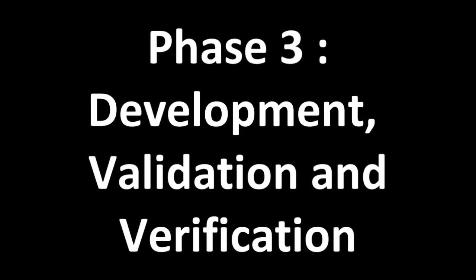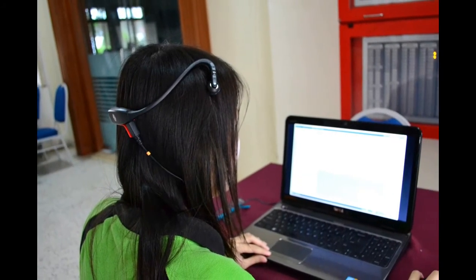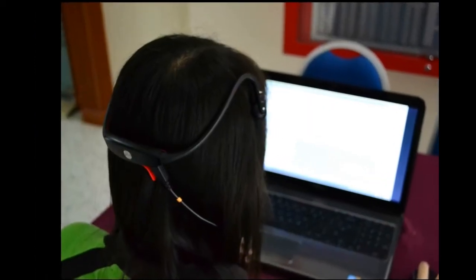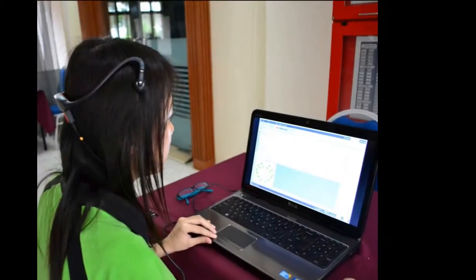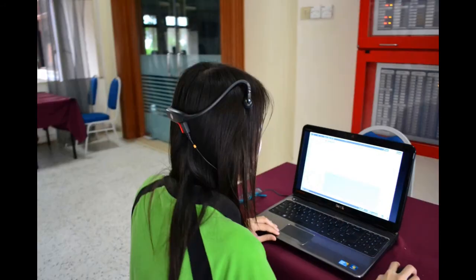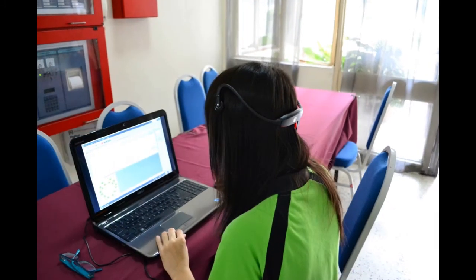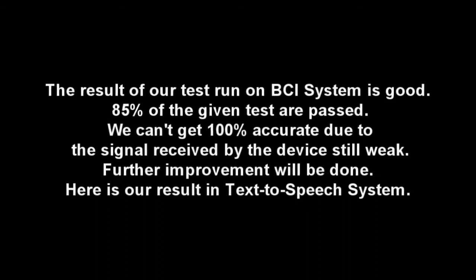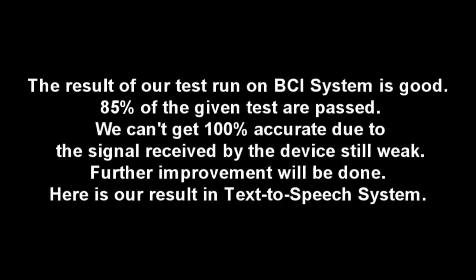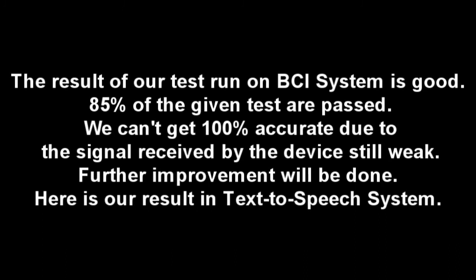Phase 3: Development, Validation and Verification. In this phase, development of our device has been completed and we are going to run some tests. As you can see, the device is mounted onto the head of the tester. Brain signals will be amplified by the device and sent to our BCI system for further processing. Data collected will then be translated into text and further sent to the text-to-speech system. The result of our test run on the BCI system is good — 85% of the given tests passed. We can't get 100% accuracy due to the signal received by the device still being weak. Further improvement will be done.